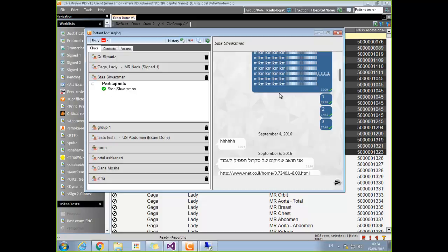Okay. We've got 30 to 40 additional features that we want to put inside chat, listed down with a ton of ideas and ways that this can be used. Mark and I talked about a few yesterday. System notifications: there's going to be an upgrade in 3 days, so we do a broadcast. We could raise events, the little flags that we have in the bottom right corner.